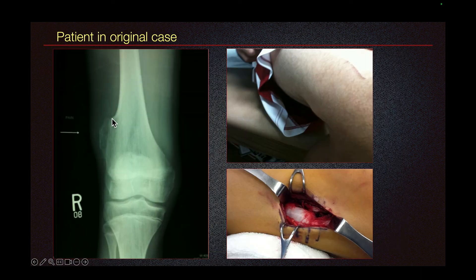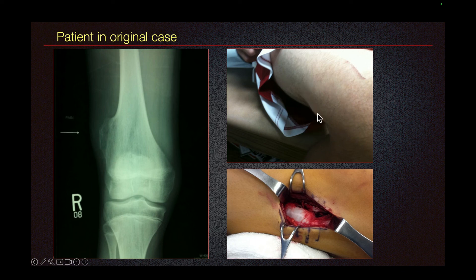So in our case, the patient has an osteochondroma and we can see that the cortex and medullary cavity is continuous. The deformity that we see on the distal thigh is due to the underlying osteochondroma. On this surgical image, we can see the cartilage cap, and the osteochondroma was surgically resected.